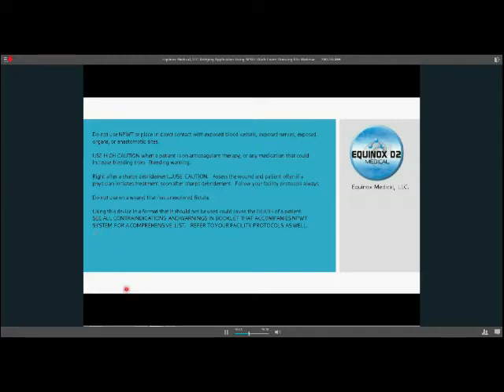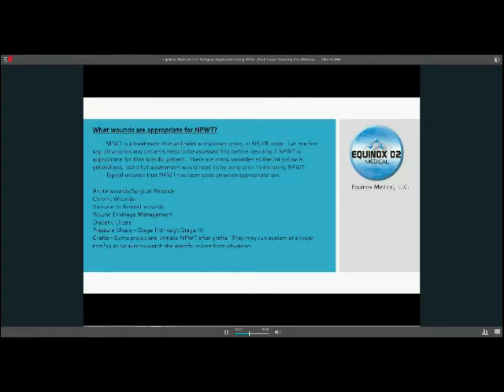A lot of physicians put negative pressure in right after a debridement, but on that you just want to use a lot of caution. Again, you're always monitoring the patient more often in those situations. Unexplored fistulas: you always want to know where a fistula goes, and again, that's through assessment and whether you or a doctor determines if it's appropriate. So just read all your booklets, go through everything before you start.